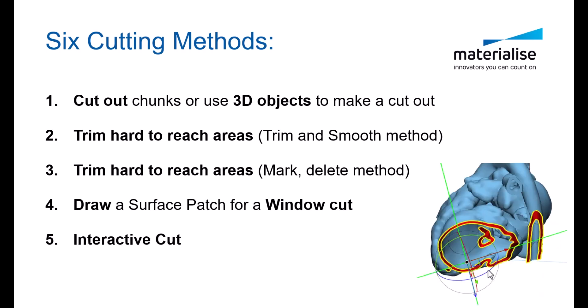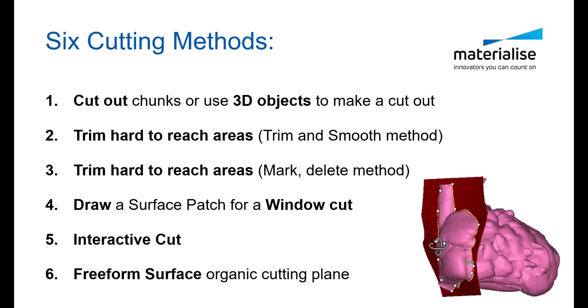Method five shown in this video is the interactive cut tool. And finally, make those organic cuts using the freeform surface cutting tool in Mimics.